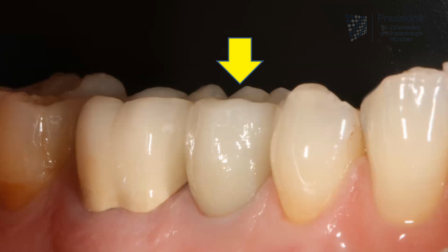And this crown was screwed in. You can see the perfect shape and health of the soft tissues. So we placed the tooth, I think, very thoroughly and very nicely with an implant supported crown.